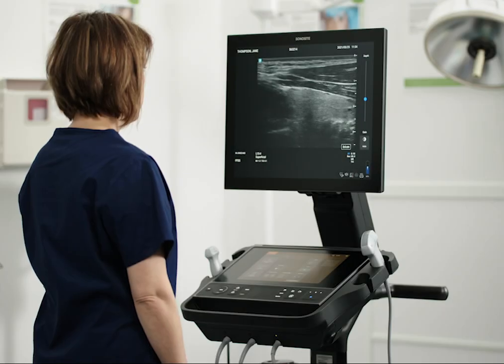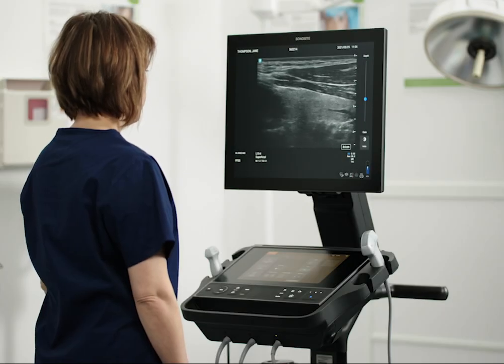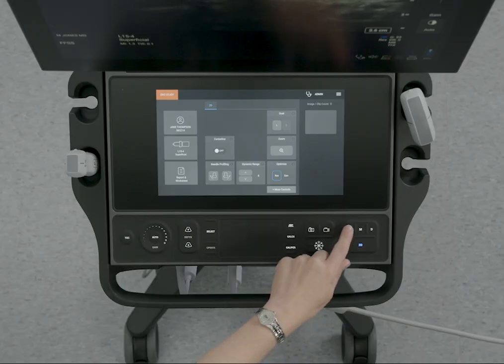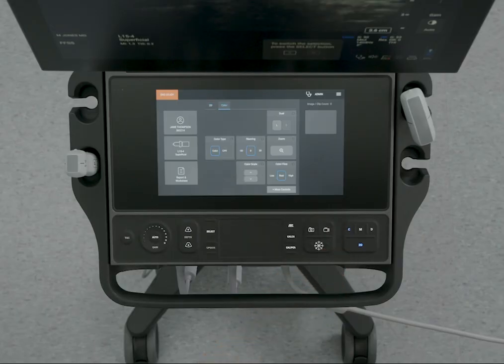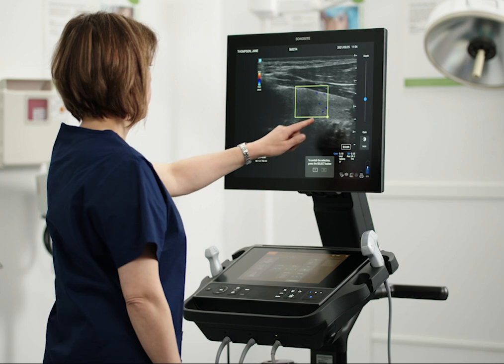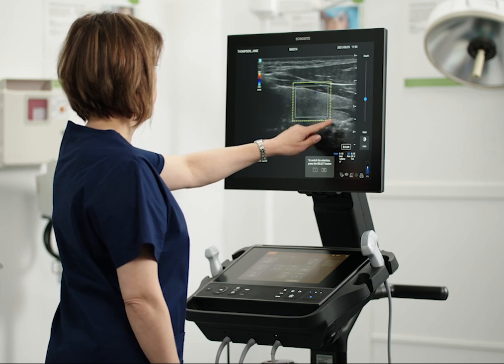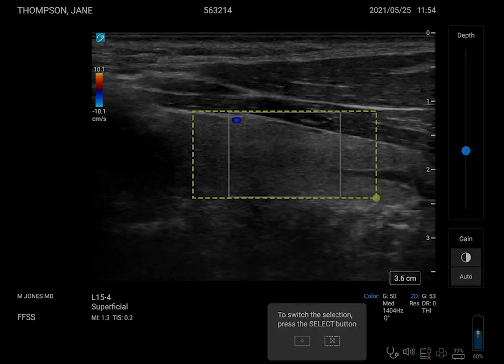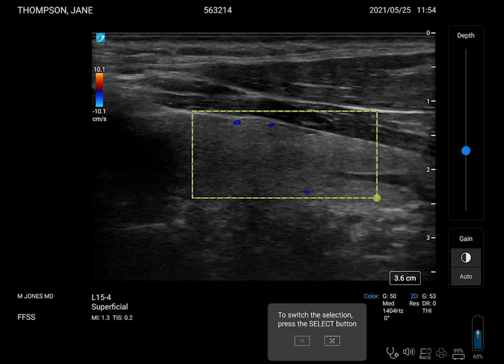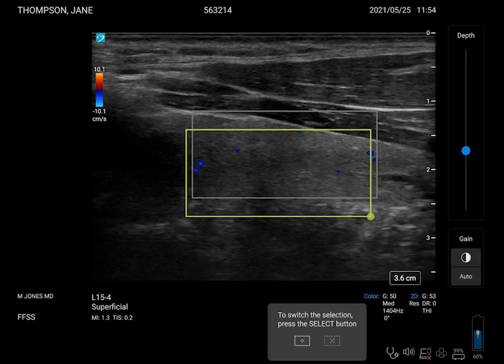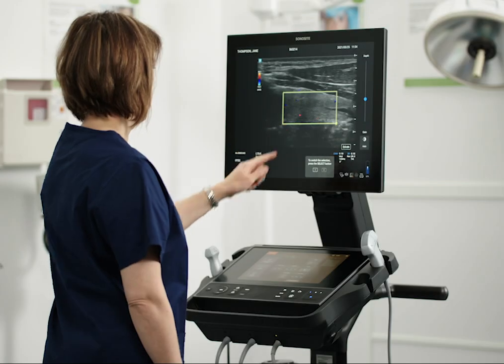Let's go back to 2D to look at color. Press C, then adjust the color parameters such as box size and placement. Use the Color Scale control to change scale.